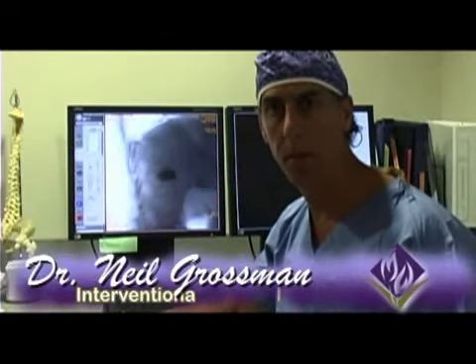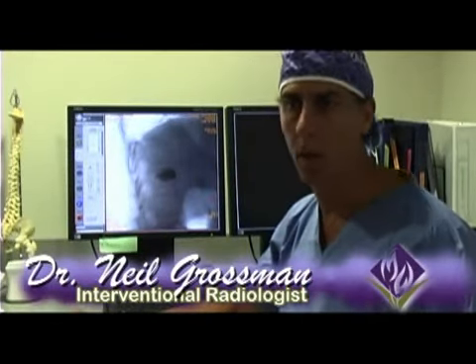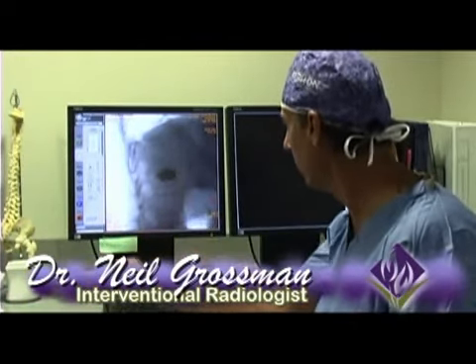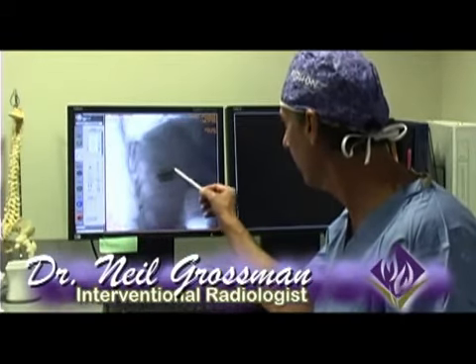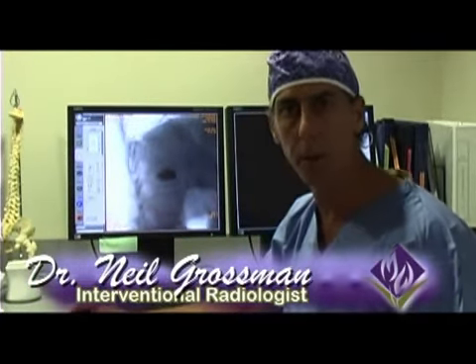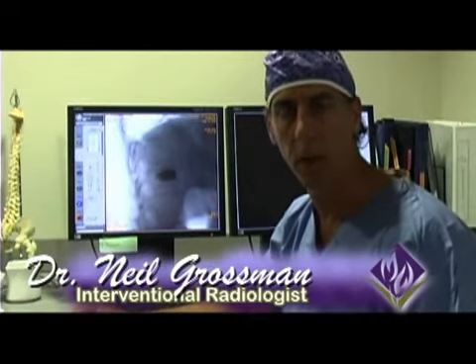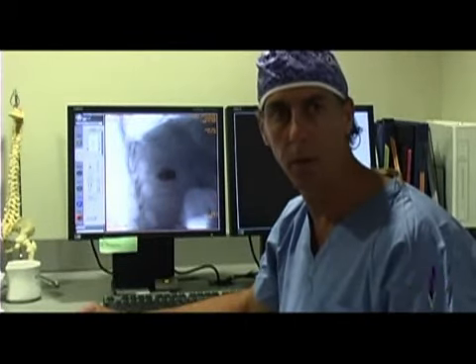The patient is now being prepared to be brought down to the recovery room to wake up from her anesthesia. Just one final look at the films. Again, we see extremely good filling of the central core of the vertebral body and protection along the undersurface of the superior end plate, which is where the major fracture was, supporting it and hopefully protecting from any further fracture. This is a very good radiographic result, but the most important result of this is how the patient feels. And when she wakes up, we will visit her and hopefully find that she is improved.